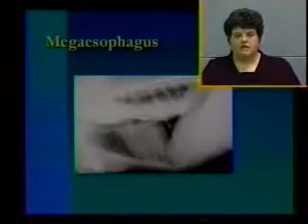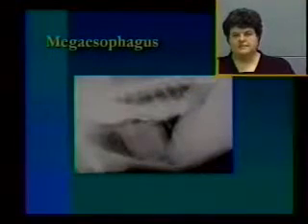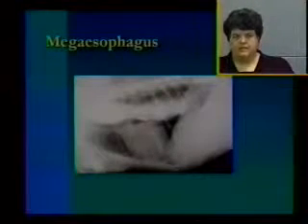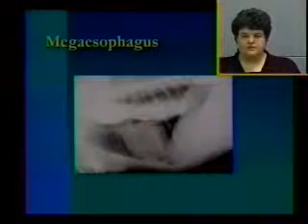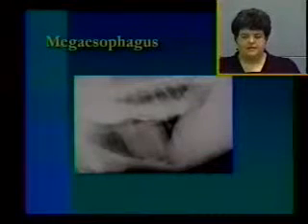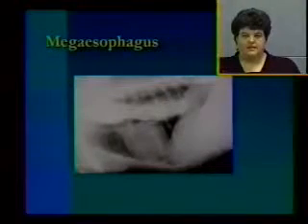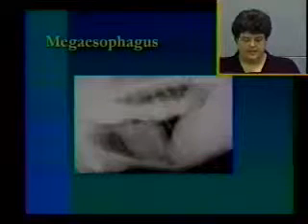Just to remind you, one of the common mediastinal abnormalities is a megaesophagus. The radiographic changes you'll see in an animal that has not been administered barium include the tracheal stripe sign, where you can actually see both margins of the trachea. You can actually see the thin walls of the air-outlined esophagus in the caudal thorax.